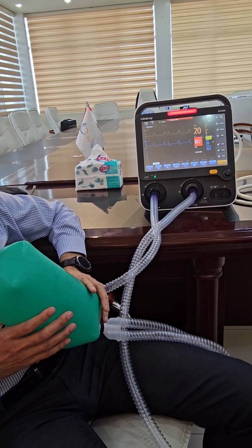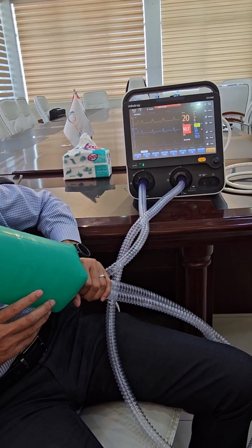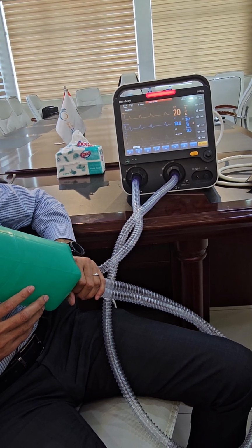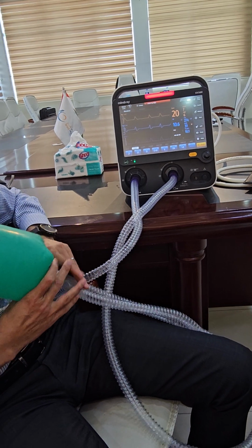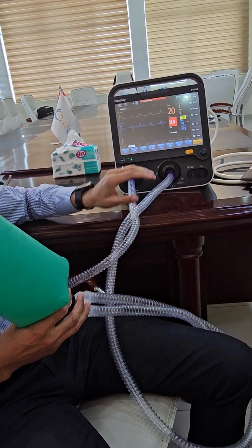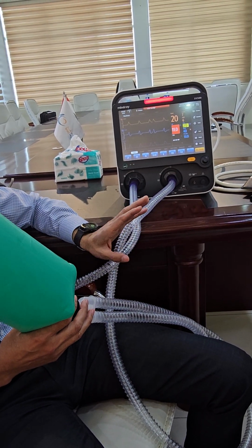In which mode is there no weaning assist? Remember it? Yes, when we took the lecture: controlled mandatory ventilation, CMV. When we choose the mode CMV, there is no assist. So if we turn it off, it's CMV now because there is no support. Okay? Now clear?